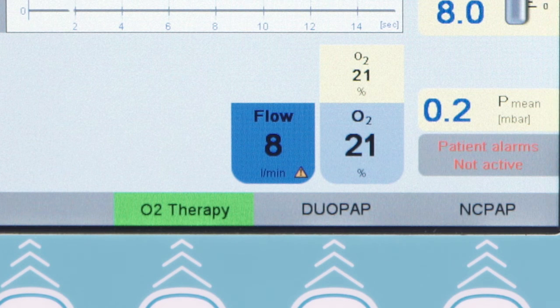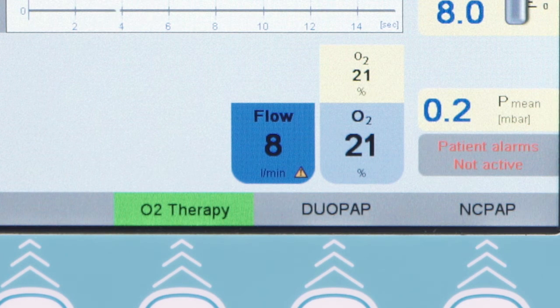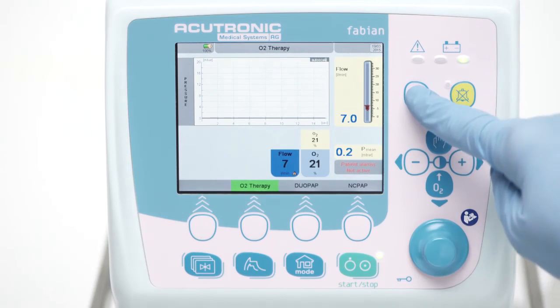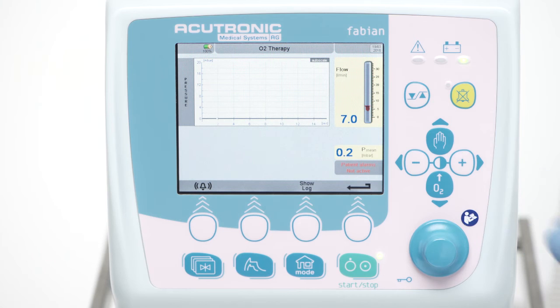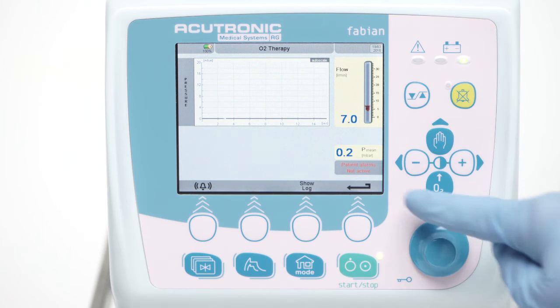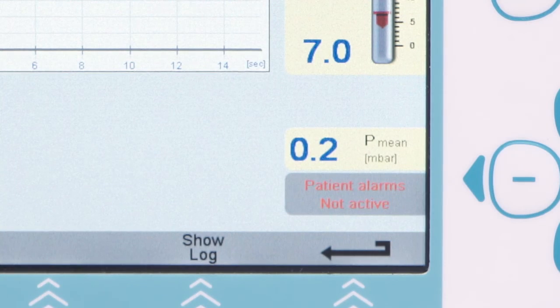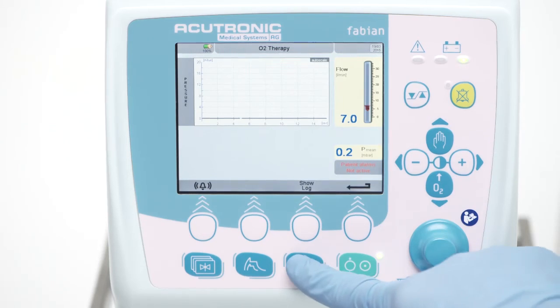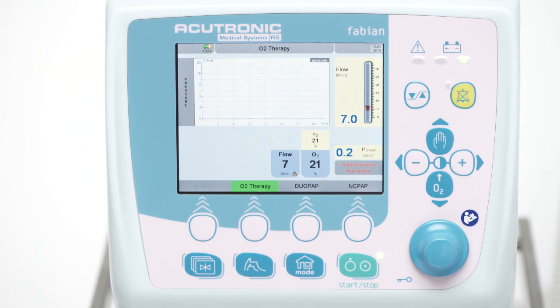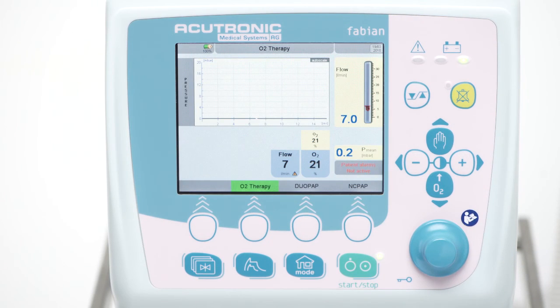The oxygen FiO2 can be adjusted accordingly. There are no patient alarms active in this modality. Pressure measurement may be possible by connecting the pressure line to a special cannula using a pressure connector.